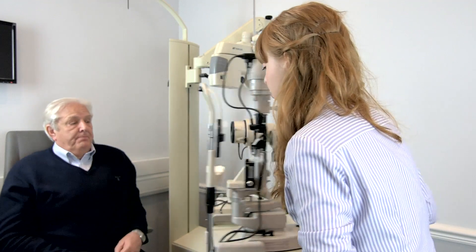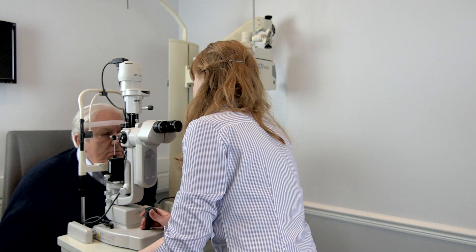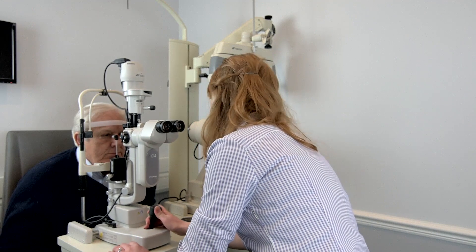Just bring this around in front of you. If you're able to come forward and just rest your chin on the chin rest and forehead against the bar. Is that height comfortable for you? That's great. Brilliant.